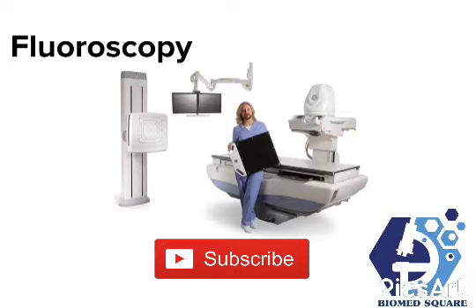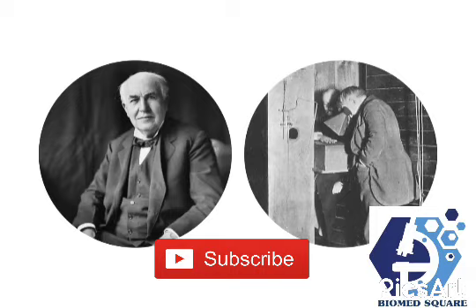Fluoroscopy, also known as fluoro, is the real-time imaging of internal structures or functions. These real-time images are called dynamic studies. Thomas Edison invented fluoroscopy in 1896.